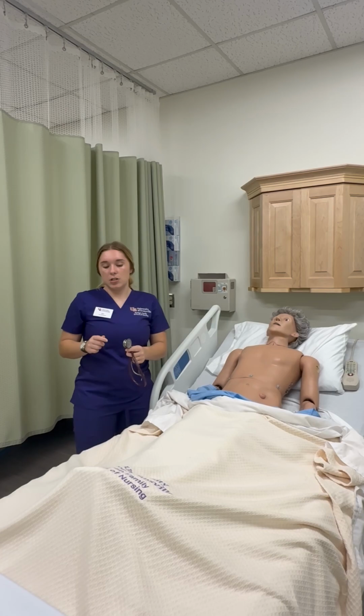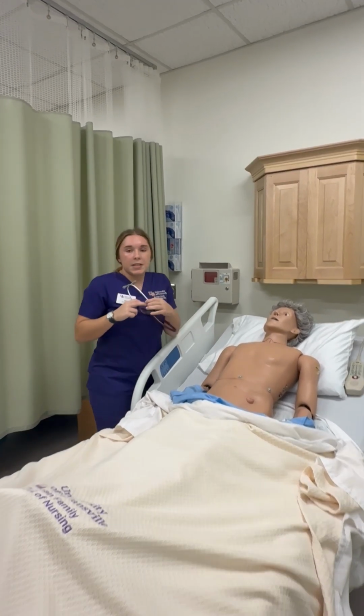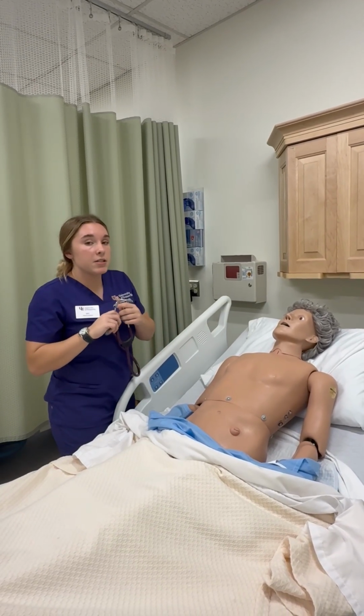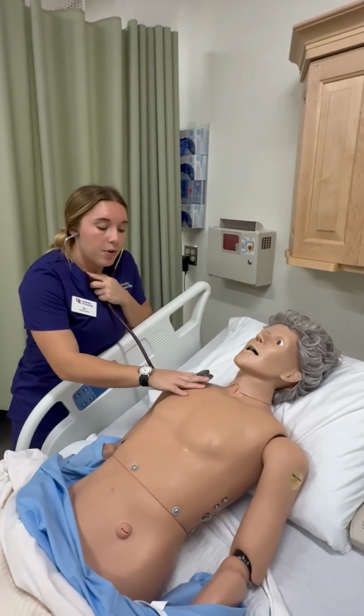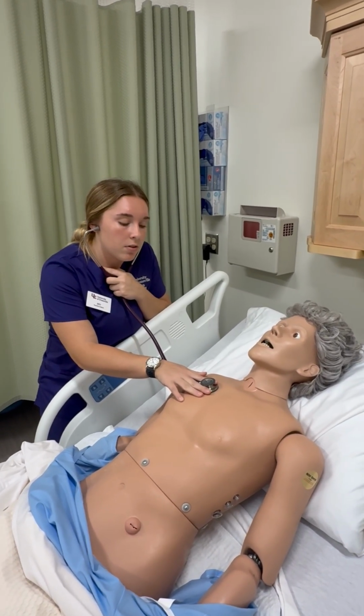For this, I'm going to use my stethoscope, so I'm going to clean my stethoscope off. I'm not going to put this all the way in my ears. For a normal assessment, I would. This is so I don't hear myself talking. So I'm first going to start at the second intercostal space at the right sternal border, and I will be listening to the aortic valve.